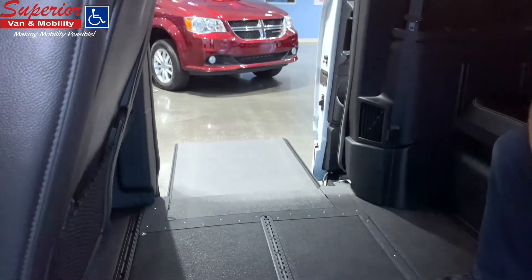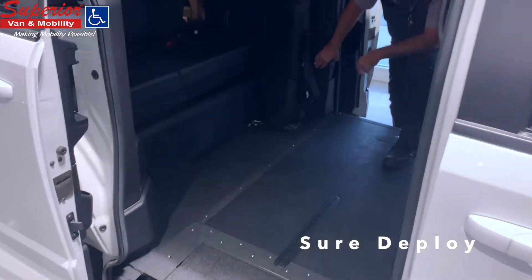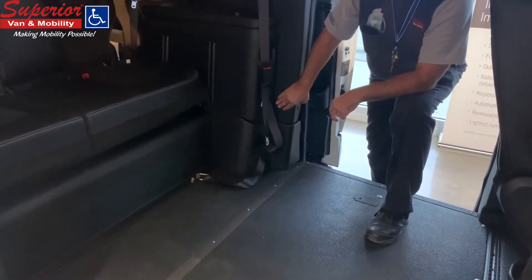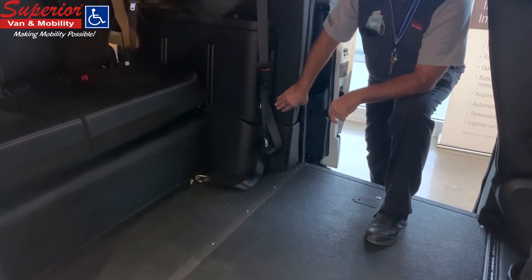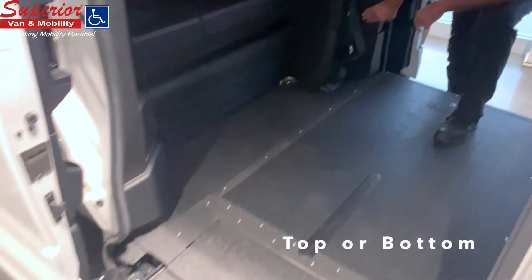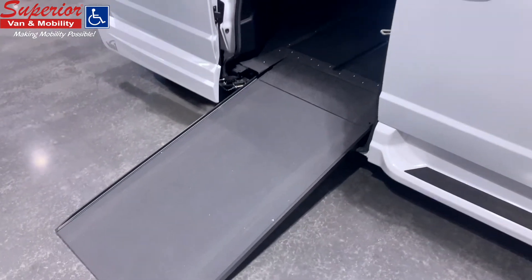Hold down the bottom of the switch labeled Sure Deploy for several seconds until the tone turns into a beep. This will activate the ramp in or out button, allowing you to stow or deploy your ramp. You can then push the top or bottom of the ramp switch to bring the ramp in or out respectively.